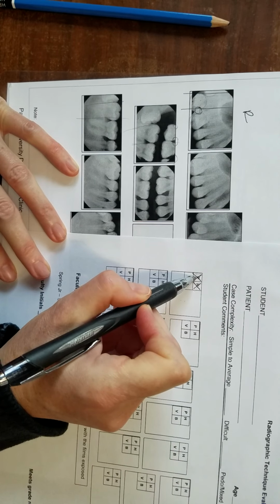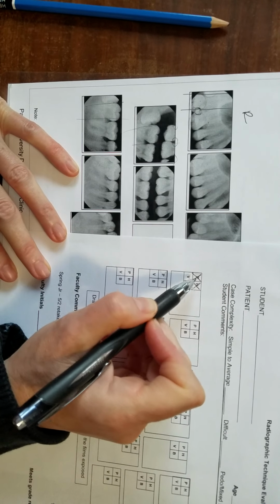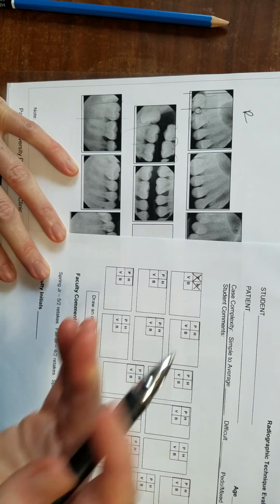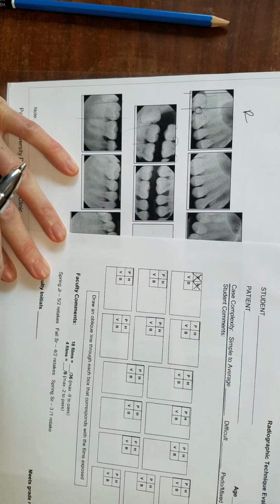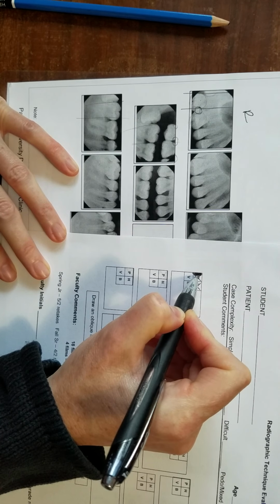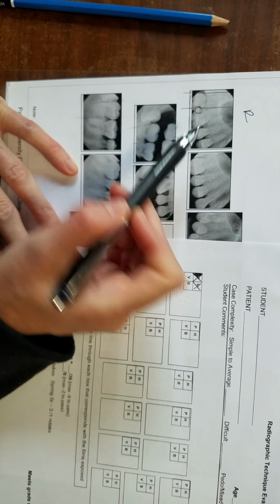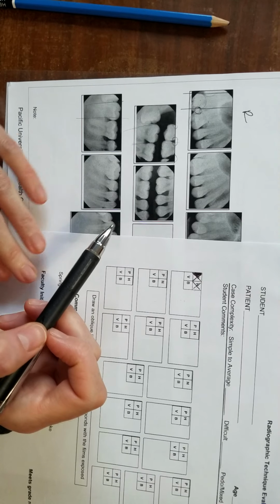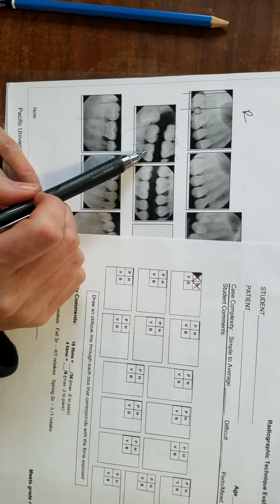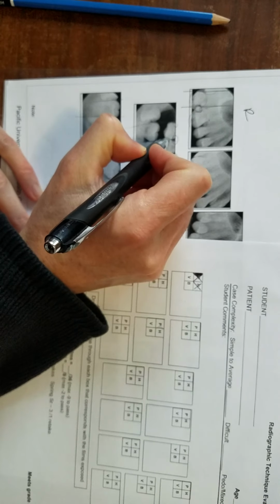And then what you do, so you mark an X, and then if you have to move your film, you want to shade the part of the X where you would move your sensor to correct the problem. So we need to move it more posterior. So I'm going to highlight the back part because we would need to move this film more posterior to center the second molar.